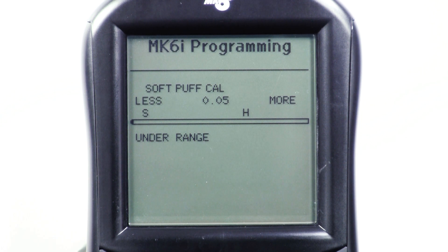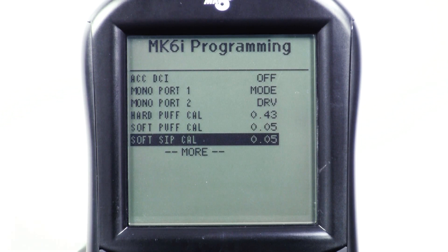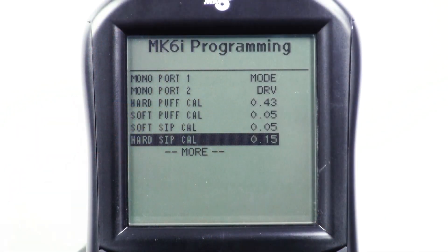When you're finished calibrating soft puff, use the menu key to back up on the programmer, scroll down to the next setting or soft sip calibration, and repeat the process. Then scroll down to the hard sip calibration and repeat the process once again.